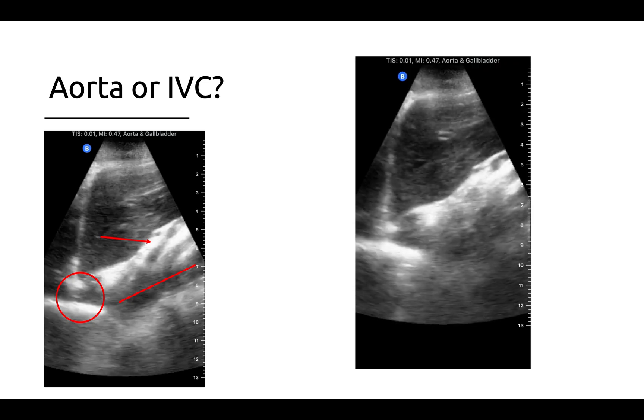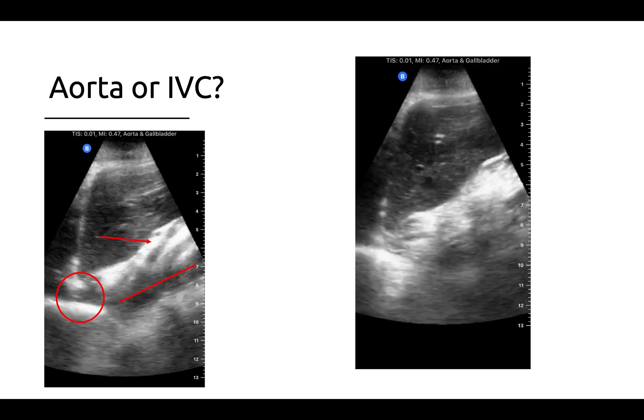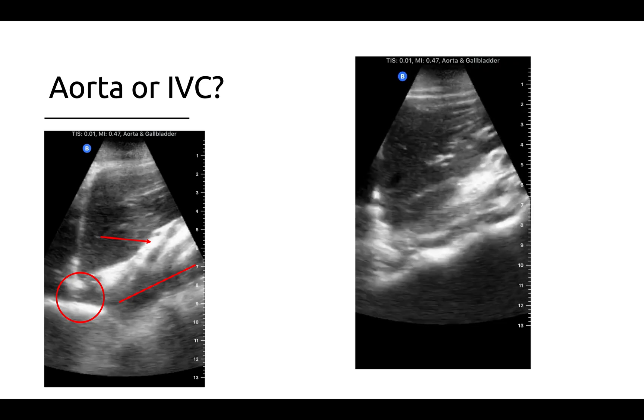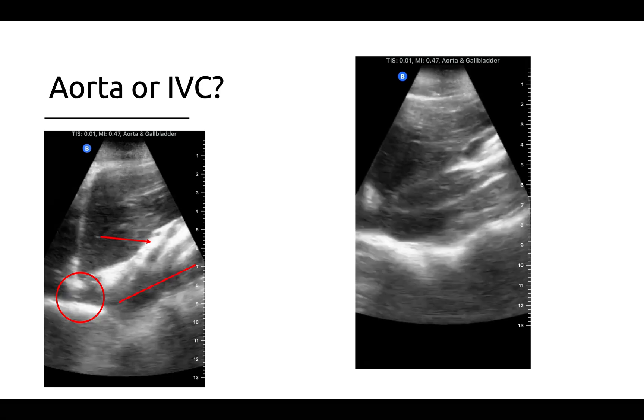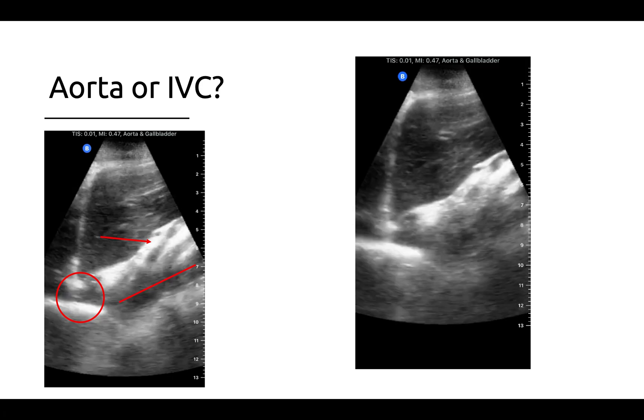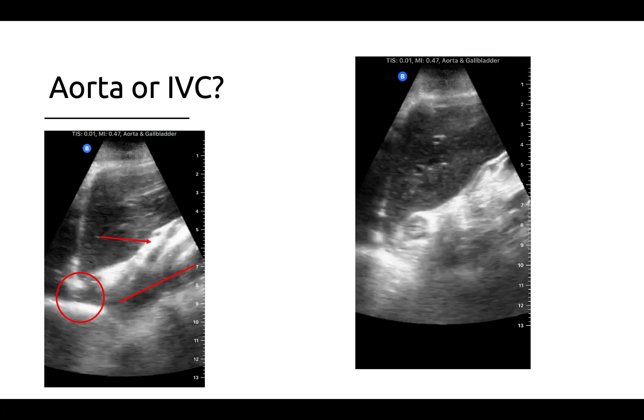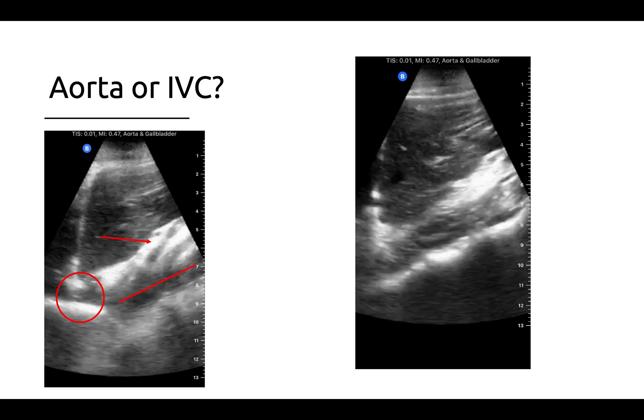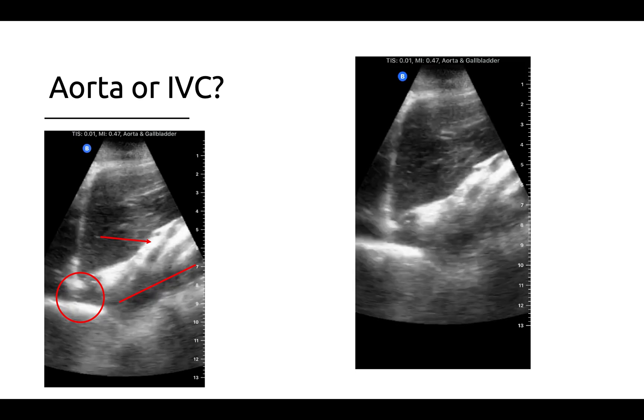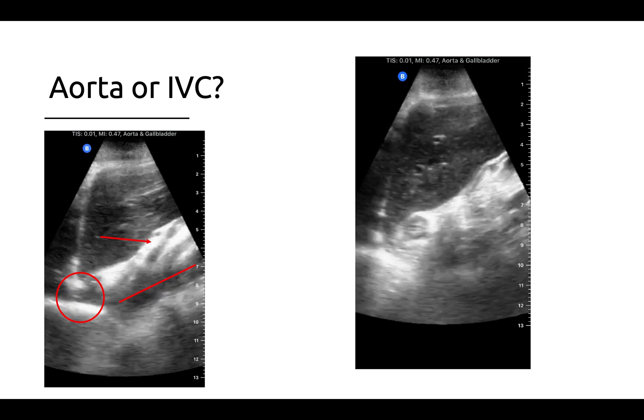As a final note, keep in mind that both the aorta and the IVC can often be seen pulsating, and that this is not a reliable marker that can be used to differentiate the two vessels.